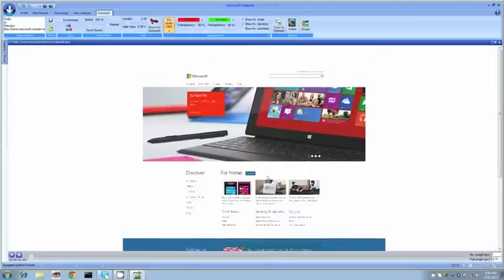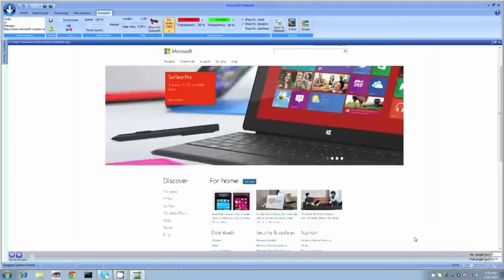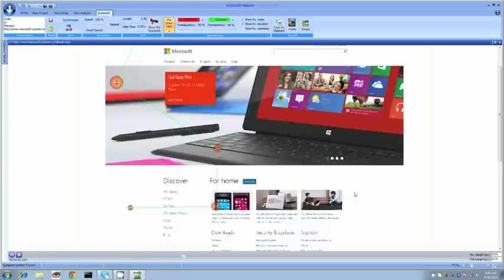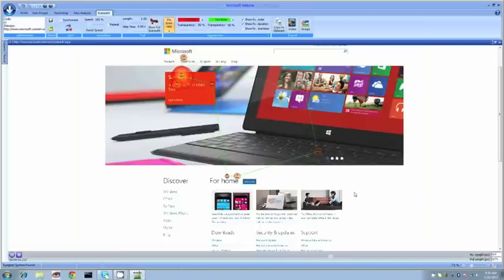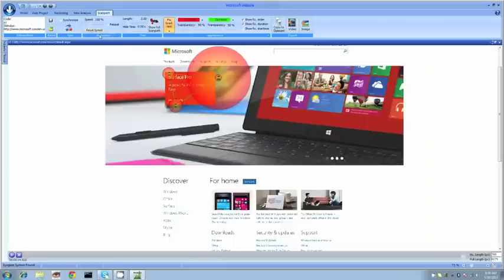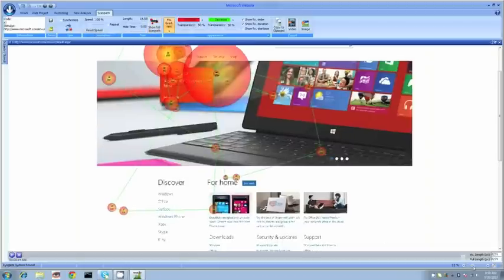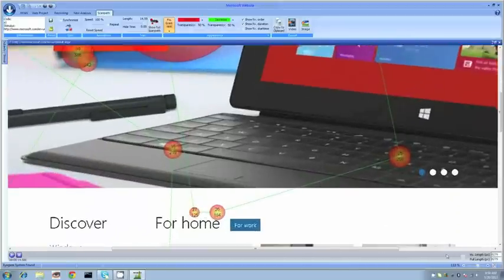I'm just going to zoom in here. When I play this back, each one of these little dots that you see on the screen is all the fixations and saccadic movements that are taking place. You can actually see where my eyes fixated when I was on the homepage here. I can show you the full path and the size of those dots indicates the duration that took place.